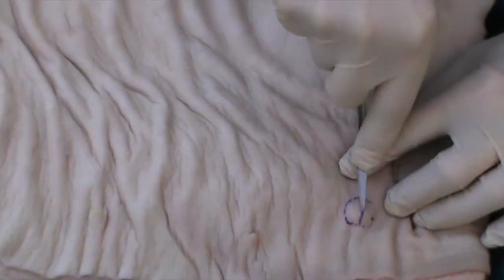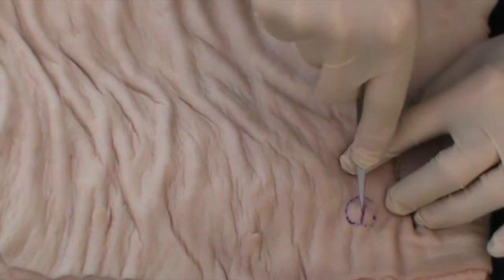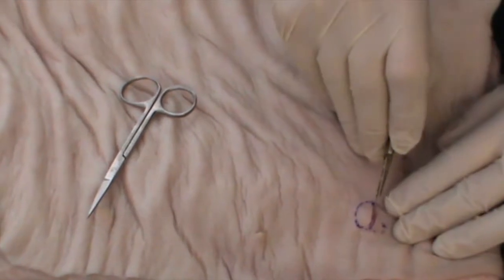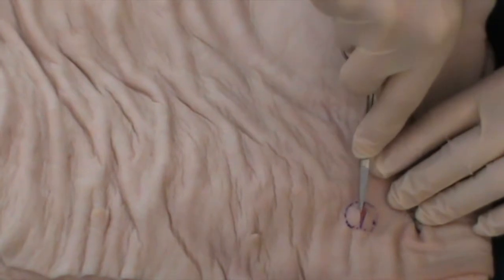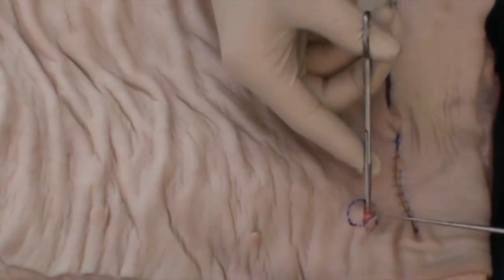This is where a gradual approach pays dividends, because if you're able to remove the cyst whole without penetrating the wall, it's a lot easier, and you can then guarantee that the cyst is more likely to come out whole. Here we can just begin to see the cyst showing up as a cyst wall. And with the use of a skin hook, we can gently dissect the overlying tissues.